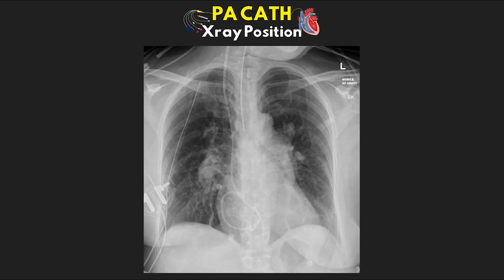Now example nine — take a look at this one and see if you can see what's happening. This one is actually a pretty interesting one. If we track along, we see that it's inserted right IJ, works its way down, and it appears to be coiled in the patient's right atrium. In cases like this, it would need to be pulled back and refloated.